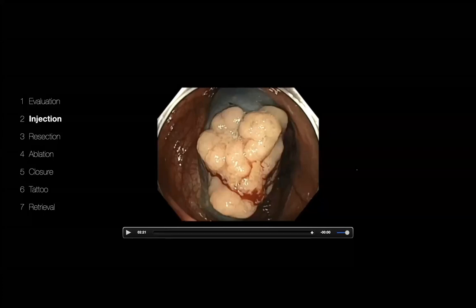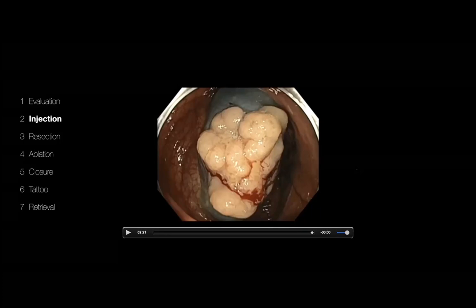And the other option, if I recall well, was laterally spreading tumor. For a few seconds, I was thinking it might be a laterally spreading tumor of granular type, but the height and the width are almost similar.